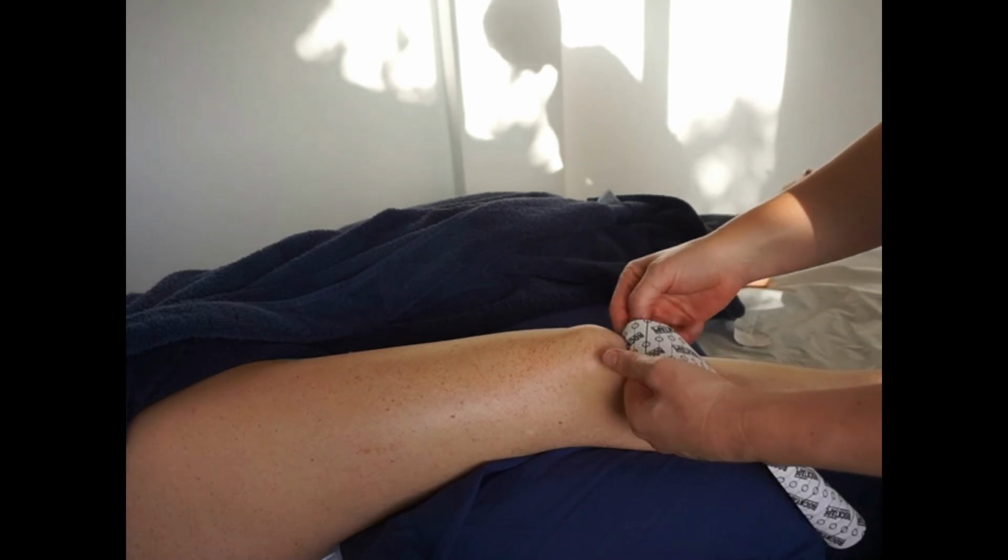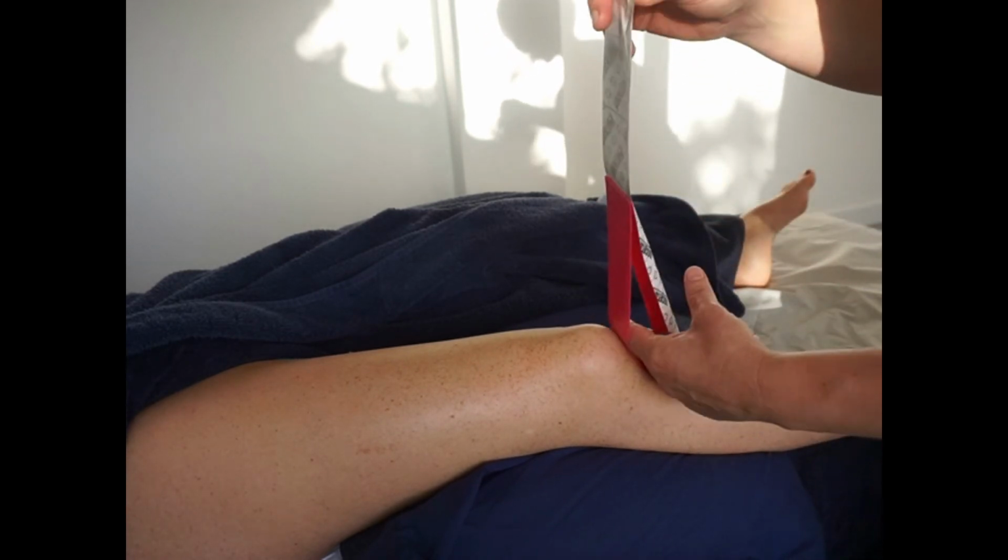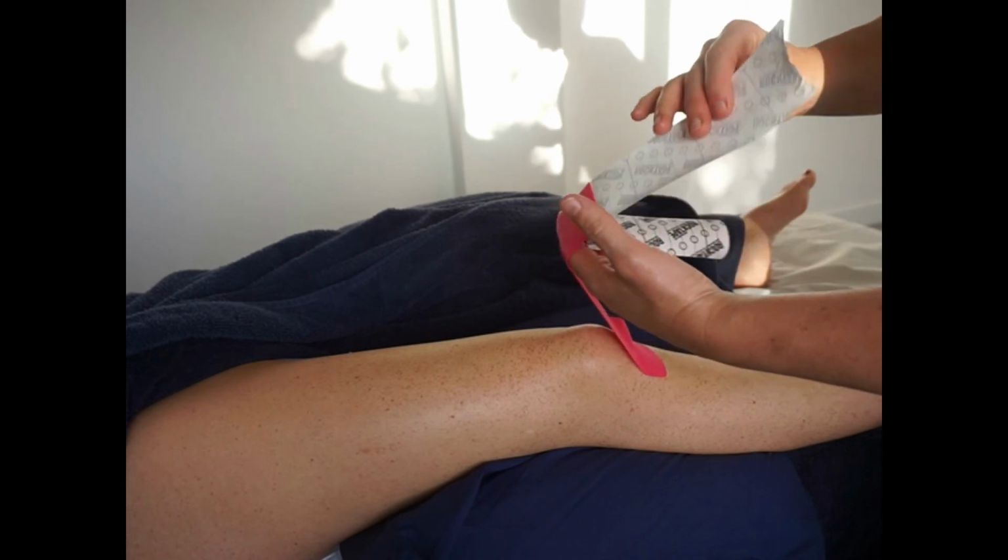So in this case, again, we want to start relaxed. We're going to anchor the tape at the distal end. So we're going to tape it just at that tibial tuberosity below the knee. No tension on the tape, no stretch on the tissue.